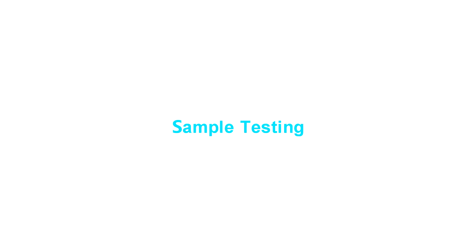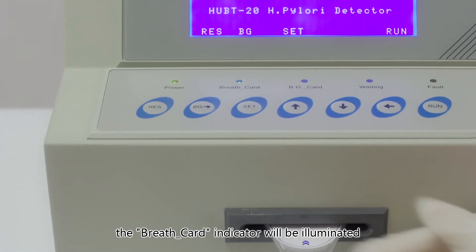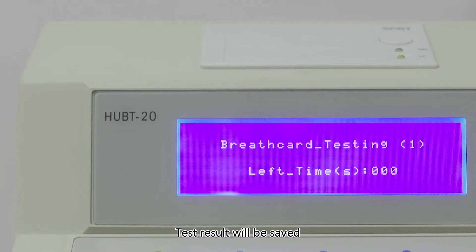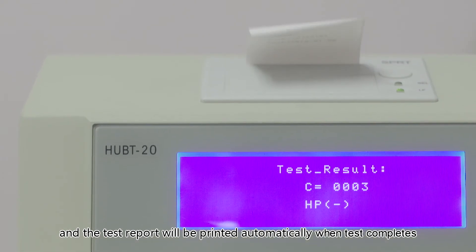Sample testing: insert the sample card into the measuring slot. The breath card indicator will be illuminated. Press Run to start the test. Test results will be saved and the test report will be printed automatically when the test completes.